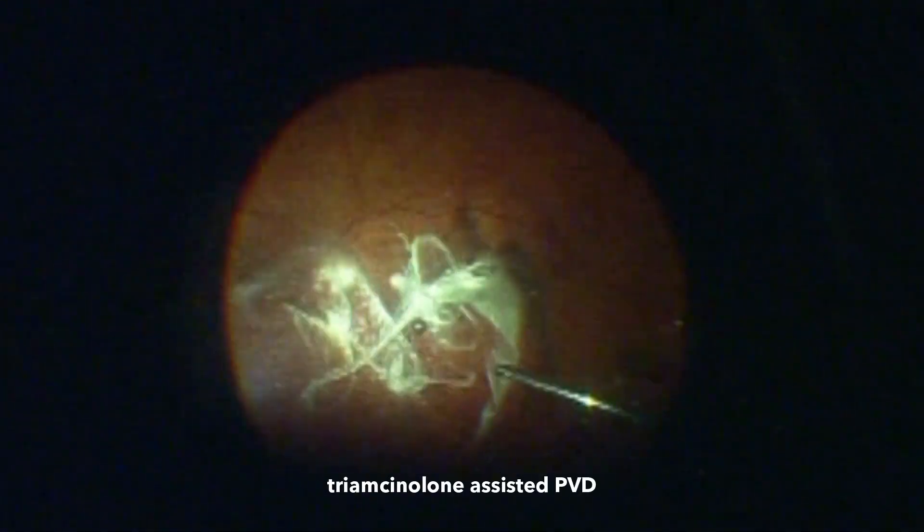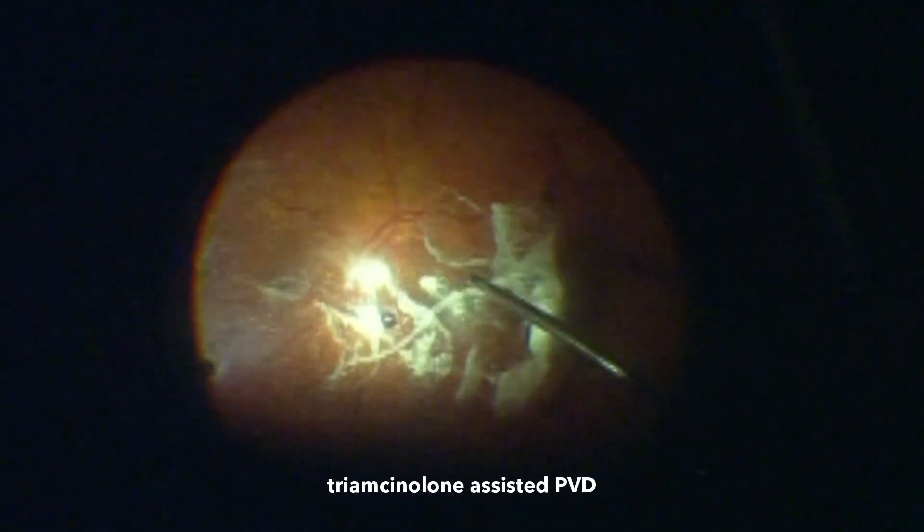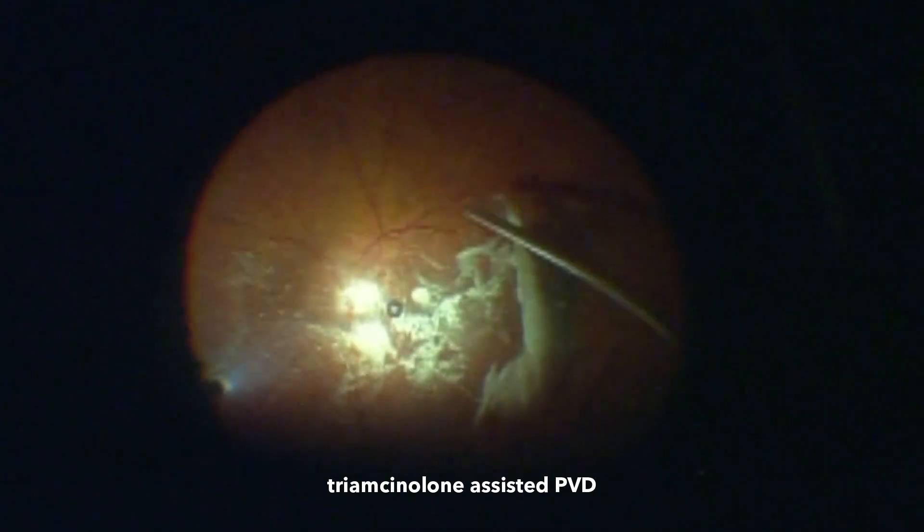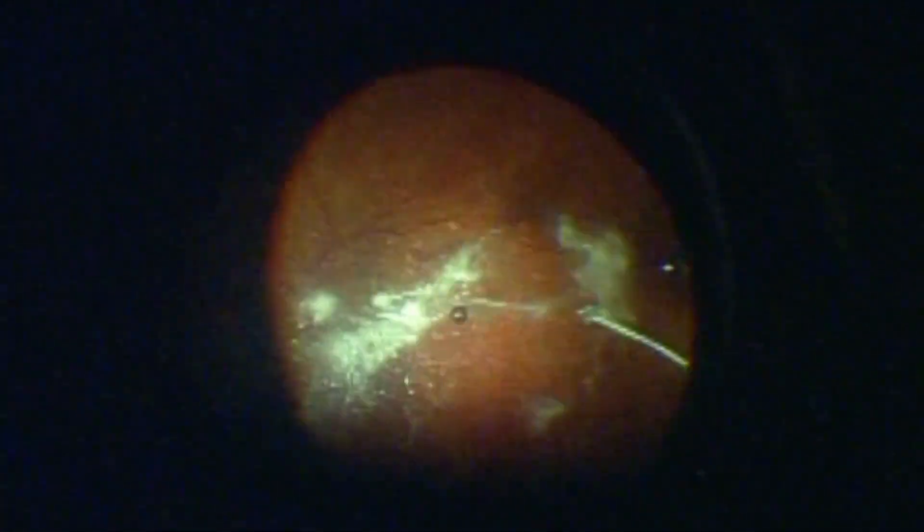Triamcinolone is quite helpful in this step, and once the hyaloid separated, the rest of the cortical vitreous was trimmed.